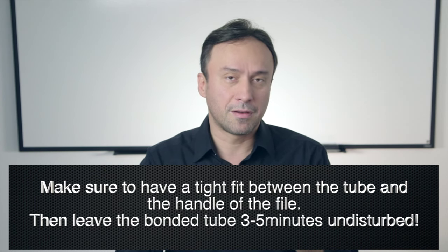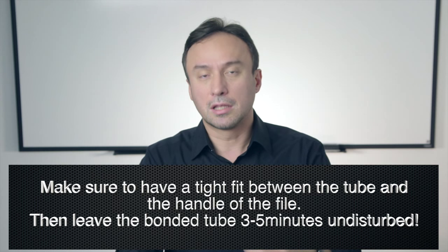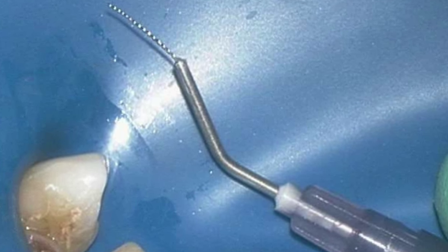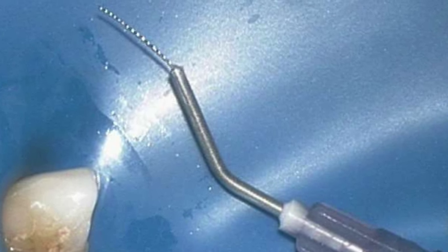Because you don't have a very large amount of material to grab onto, the longer you wait the better, as you're counting on very close proximity between the cyanoacrylate and the broken segment as well as the walls of the cannula. By waiting long enough, you then very gently try to remove the material, and suddenly it comes out — with the broken segment coming along very easily. You can see that the segment is now lodged with the cyanoacrylate, the crazy glue, right here in the hub. And that's done.